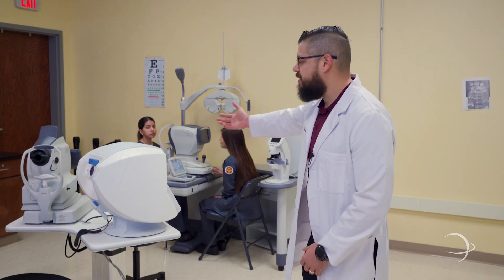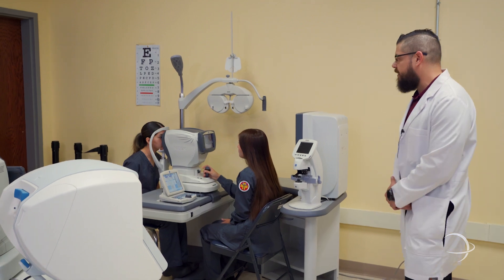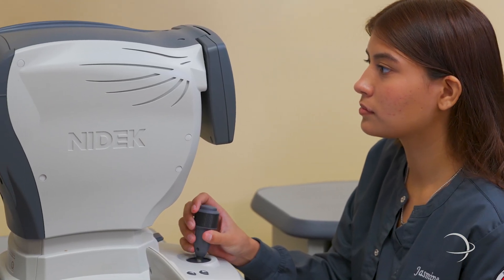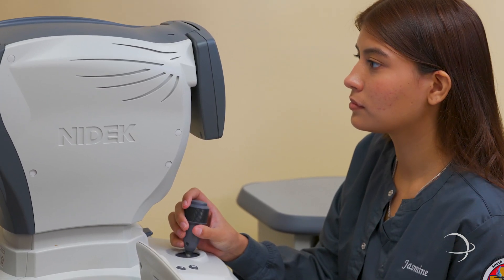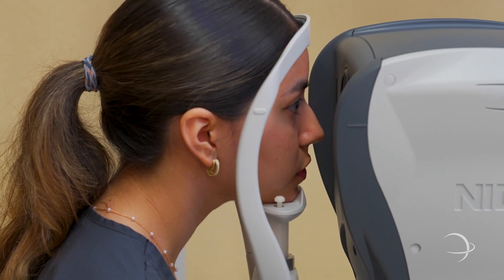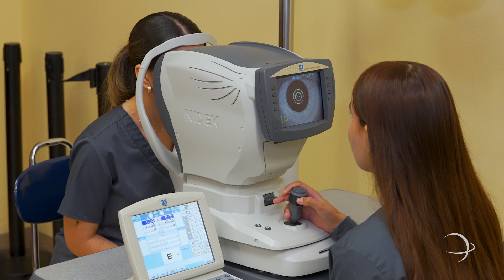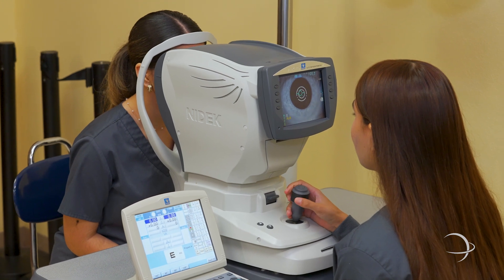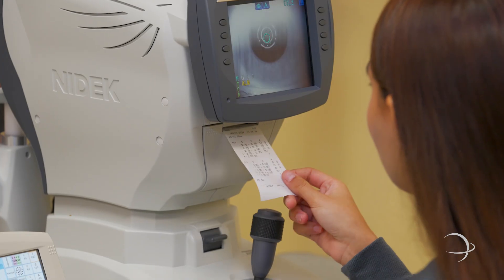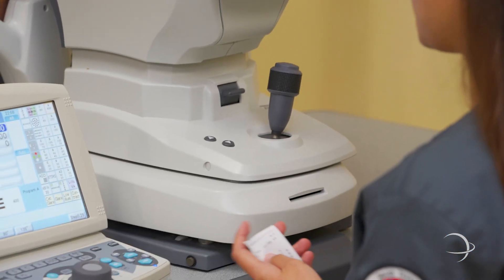If we walk this way, we have the autorefractor. We have our two students. The autorefractor checks the refraction — in other words, what prescription is going to be needed for the patient. In this case, it is automatic, which means it is a point-and-shoot system. You see the student lining up to the center of the pupil. Once the tech receives the results, they obtain them and take them over to the ophthalmologist or optometrist for the reading.